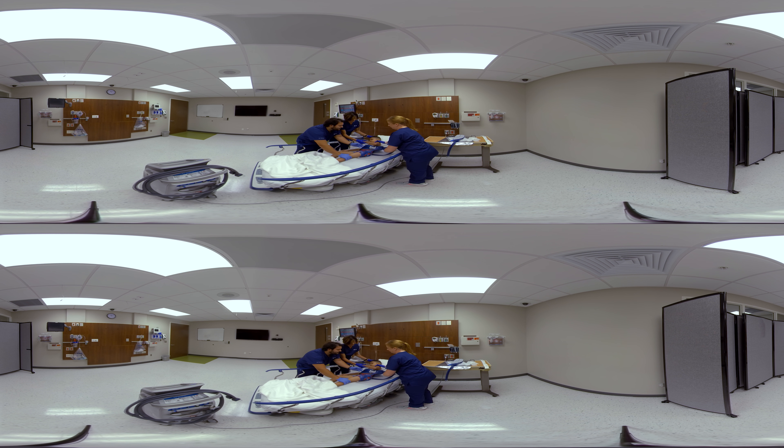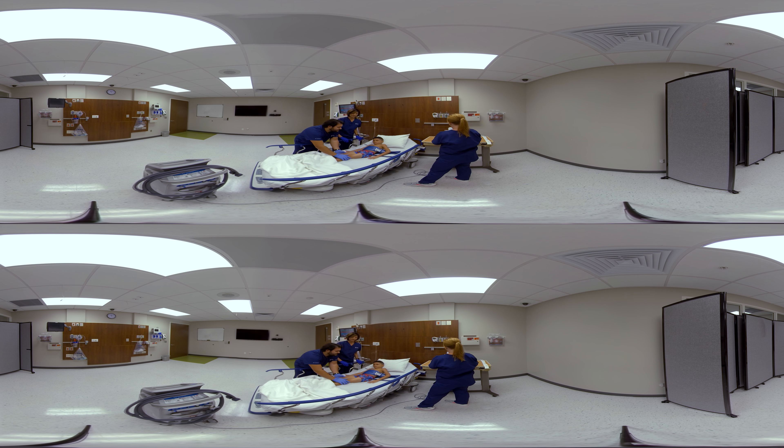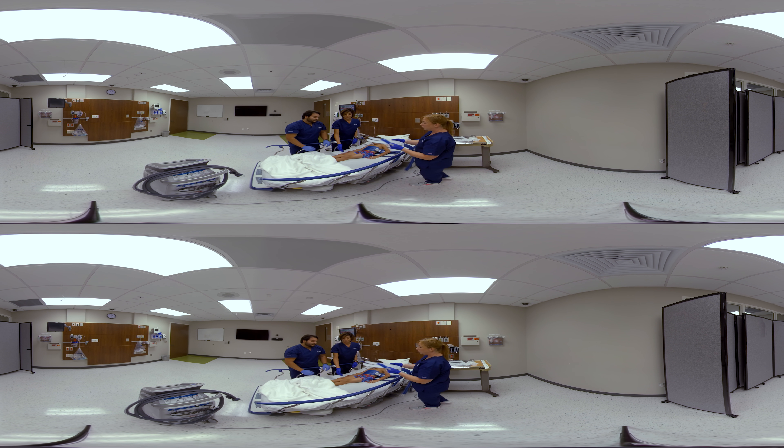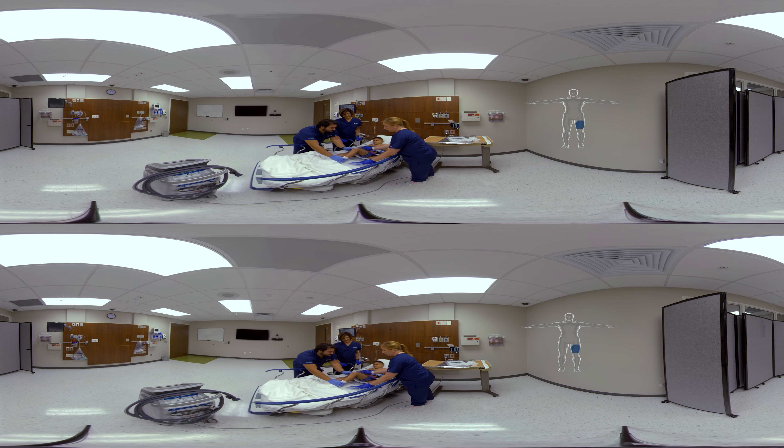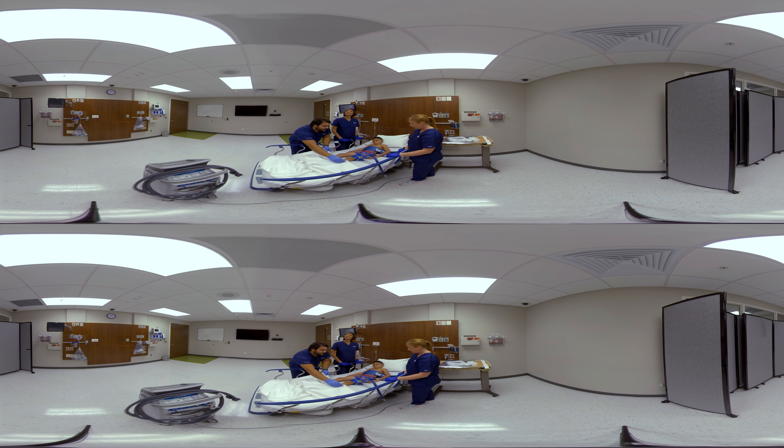Now we can roll him back. Should you choose to use the small universal pad with the cloth liner in place, you can place it around the patient and use the Velcro straps that come in the package in order to secure it next to the patient's skin. We want to make sure that the hoses are pointing towards the side of the bed that the Arctic Sun is on and that they're not kinked for optimal water flow.